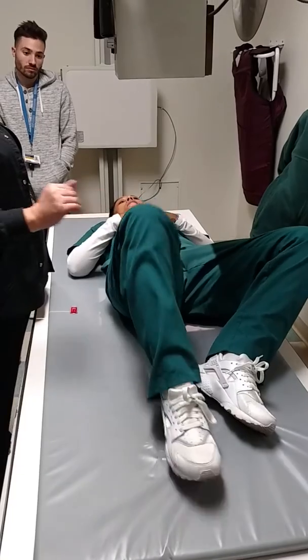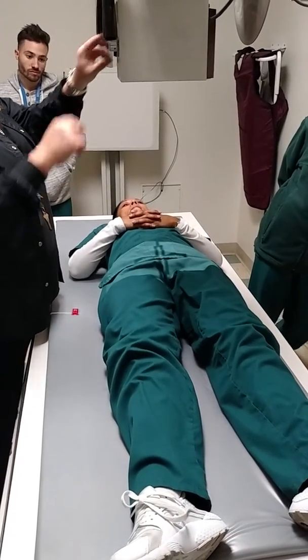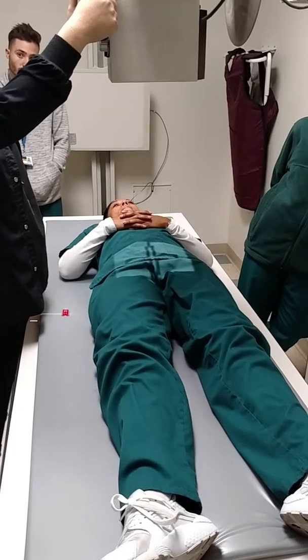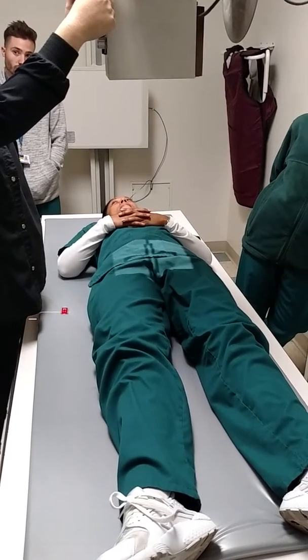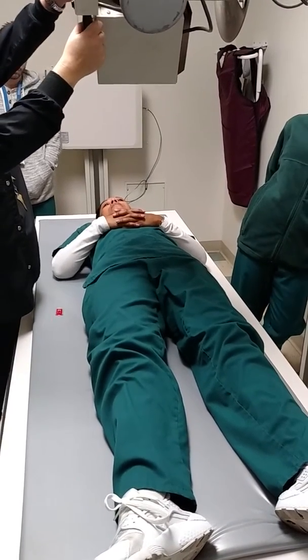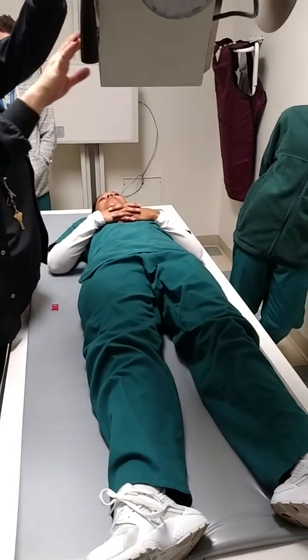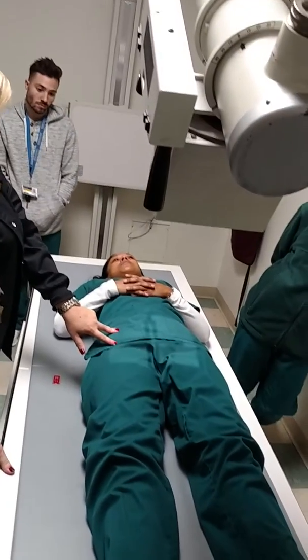All right, straight legs. So now we need an outlet, where the baby comes out. And since we're only looking at pubes and ischia, we can fit that on a 10 by 12. She is a woman, so how much? 20 to 35? That's a man. Women need more, 30 to 45. So just keep both people on 30 and you're safe. And if I ask you the question and you don't know, that's 5 points, but putting it on 30 for both works. All right, central ray is 1 to 2 inches below ASIS.